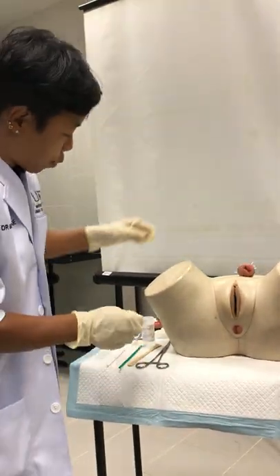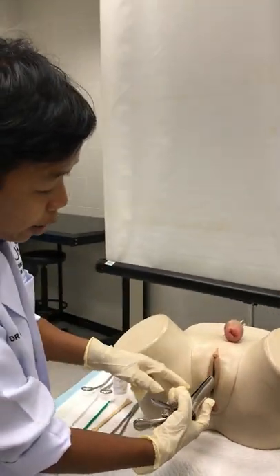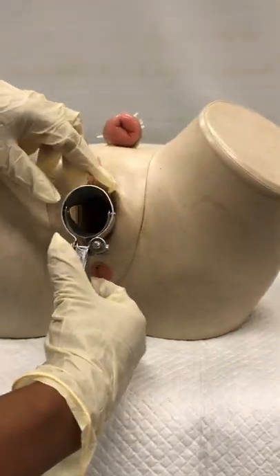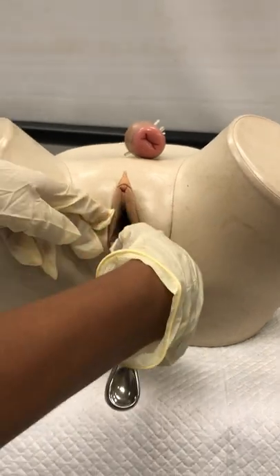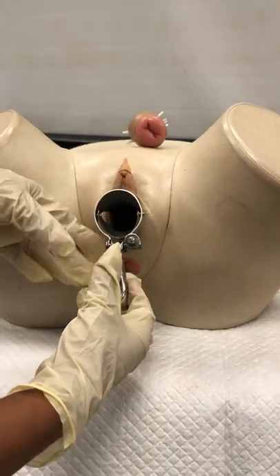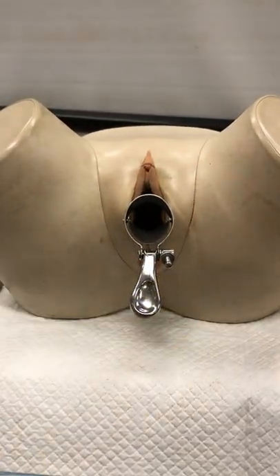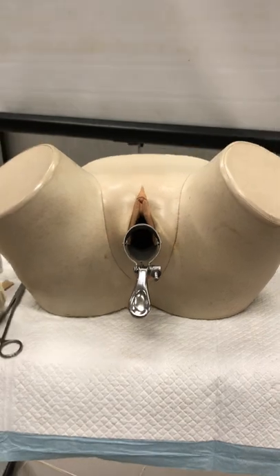Now we put the speculum in. There are two ways: you can insert it sideways and then turn it inside and open the speculum to visualize the cervix, or you can insert it straight in a straight line, then open it until you visualize the cervix. Then tighten the screw so that you don't need to hold the speculum.